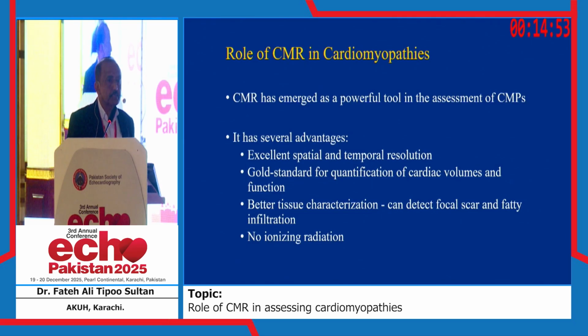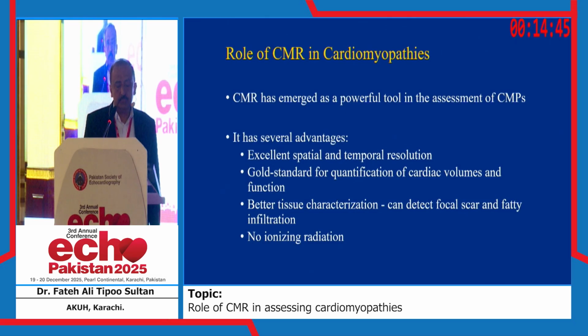It has several advantages. It has excellent spatial and temporal resolution, is the gold standard for quantification of cardiac volumes and function, offers better tissue characterization, can detect focal scar and fatty infiltration as well, and there is no ionizing radiation.